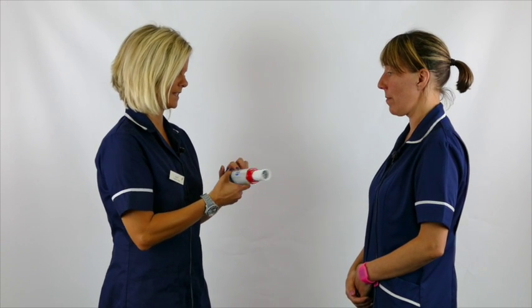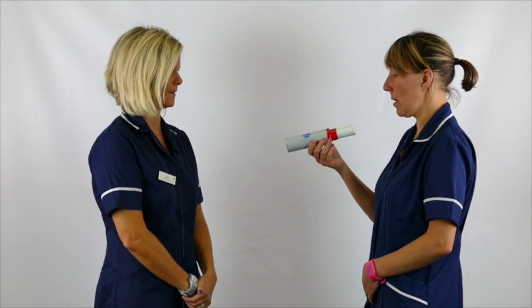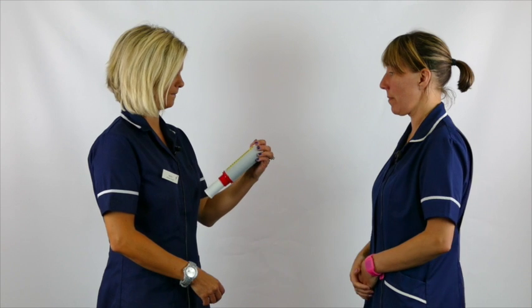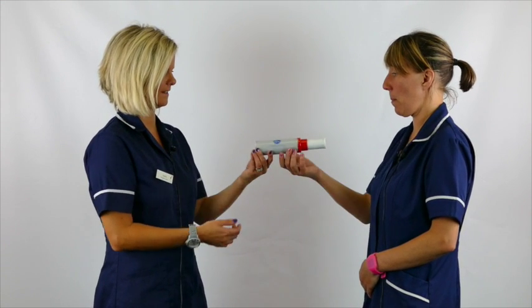So that was 420. Okay, I'm going to do another one. I'm going to do the best of three. Exactly the same again. 440. And last one, exactly the same.